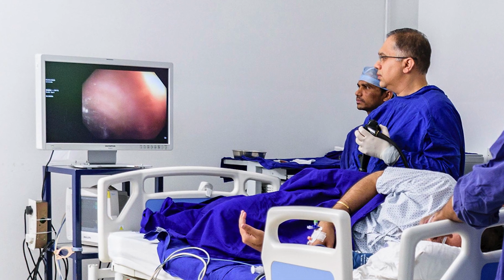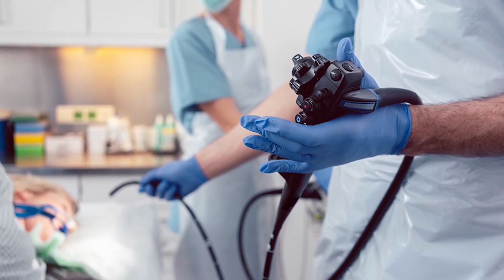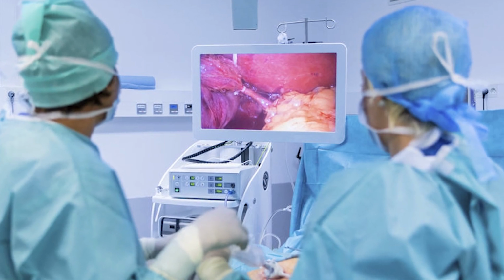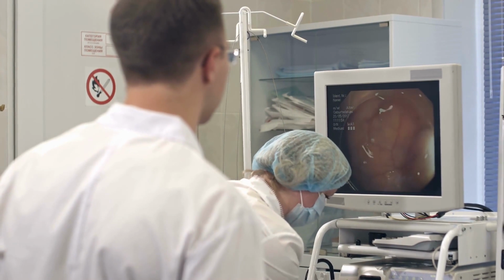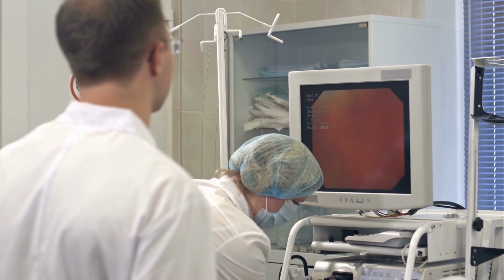In an upper GI endoscopy, the gastroenterologist uses a slender linear tube which is passed across the esophagus, or food pipe, into the stomach and duodenum. It can be done under local anesthesia or intravenous sedation, depending on the patient scenario. When it is done under local anesthesia, we usually spray a local anesthetic to the throat of the patient, or when it is done under IV sedation, we give an IV anesthetic drug which lasts for the next 15 to 20 minutes.